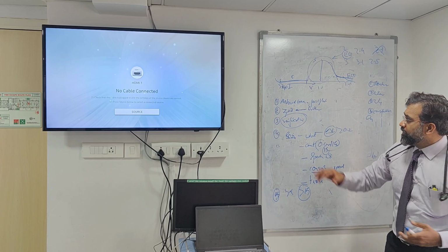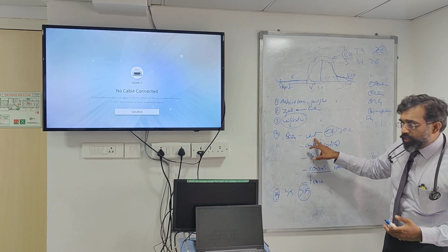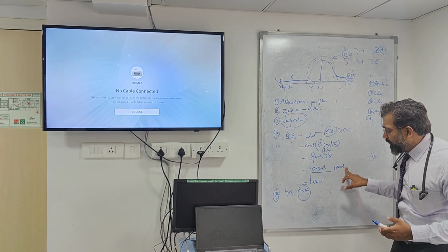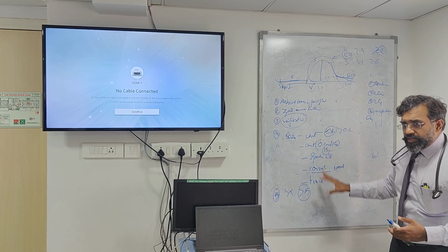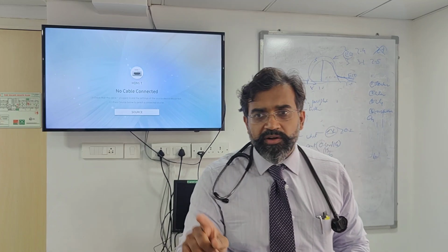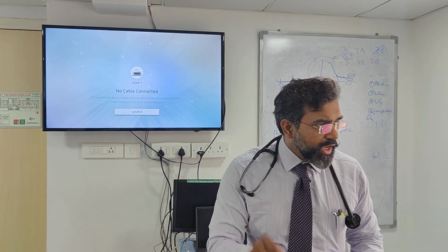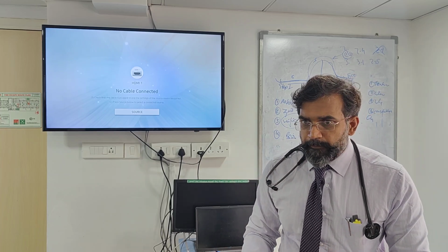Then what is the fluid I'm going to use? Is the temperature right? Is the speed right? Is the consistency right? And then is the trace right? When you put all of these together and confirm 3 readings that have been within 15% of each other, then you have a reading that you can rely on. Clear on this till now? I hope I'm very clear.